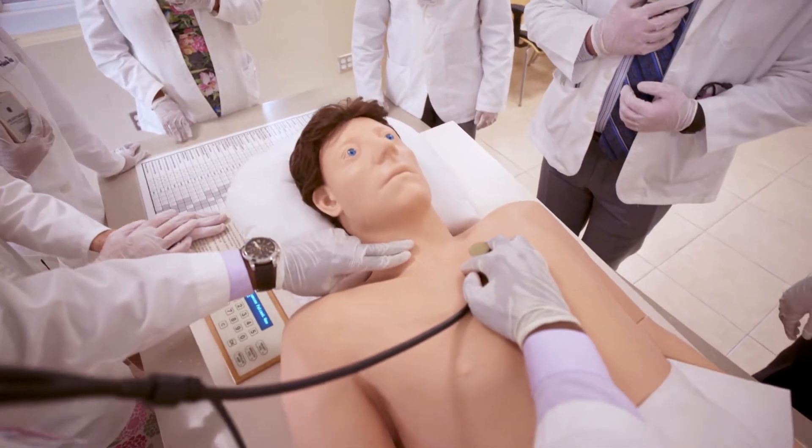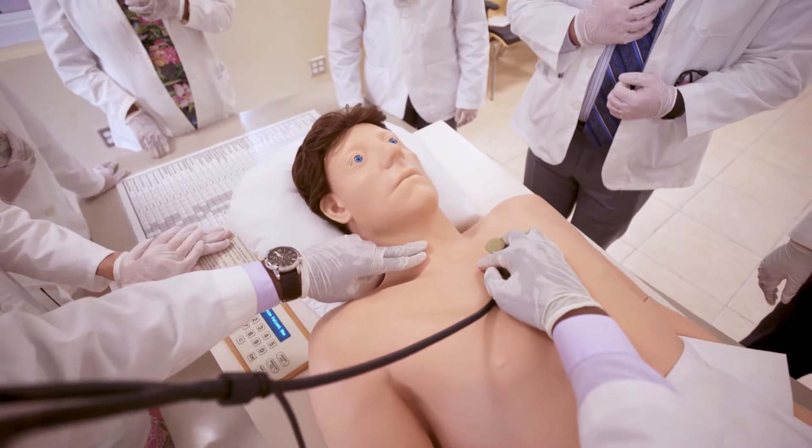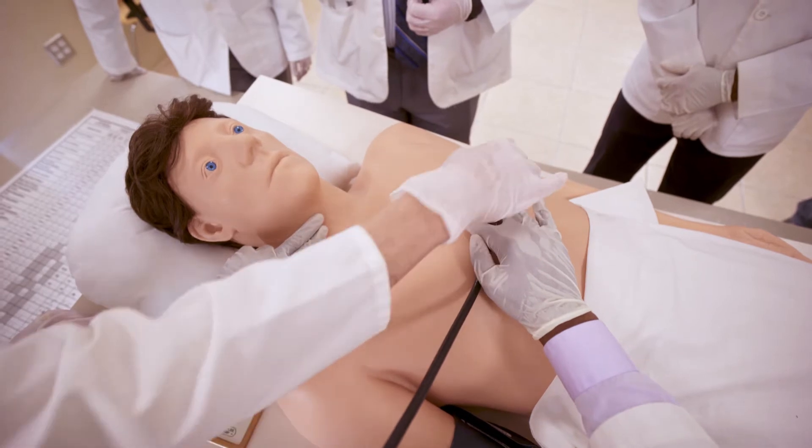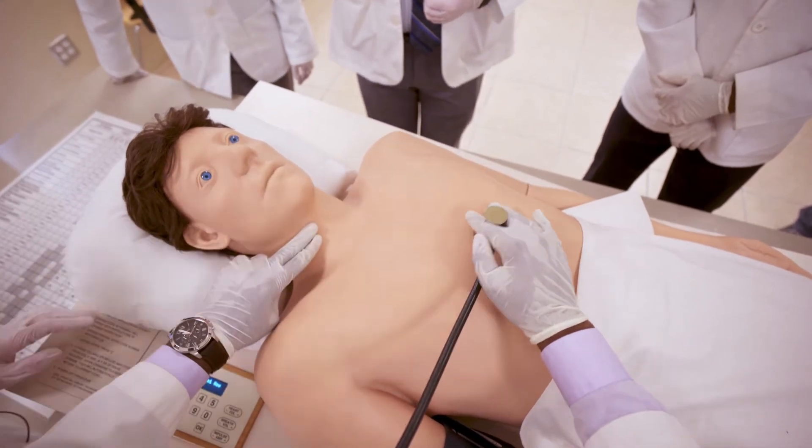Would you like to listen in the other areas? So now you're in the pulmonary area. Now take the stethoscope down the left sternal edge for the tricuspid area. And now you can put it over the mitral area.